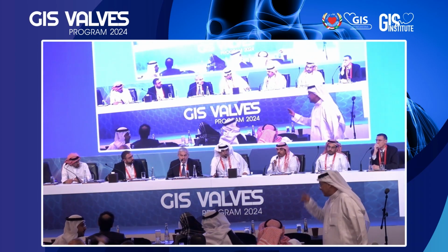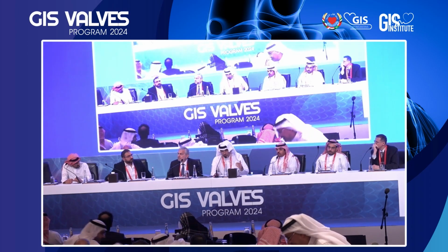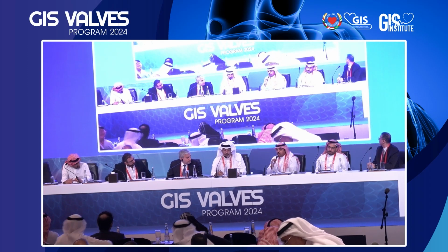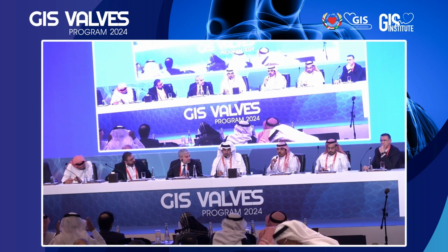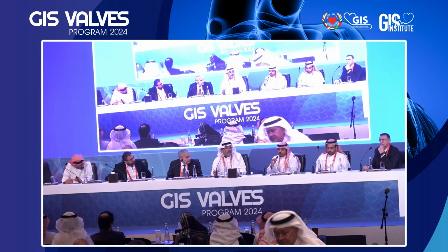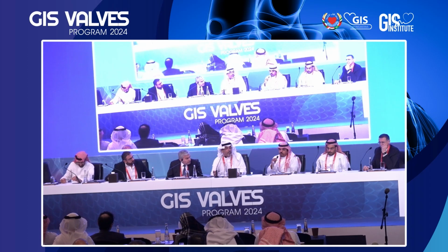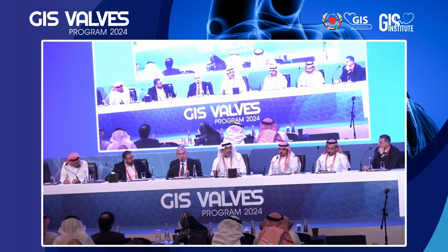Let me ask Abdulrahman, have you seen suicide ventricle with a low gradient? Paradoxically, you have seen it with the critical, yes, but again, as a rule of thumb, this is kind of a prerequisite when we do those low flow, low gradient cases, because you do run the risk of suicide ventricle. You don't commonly see it with the balloon, but after you put the valve in and the patient is not properly filled in, and you have this massive LVH and contractility, then you run that risk.